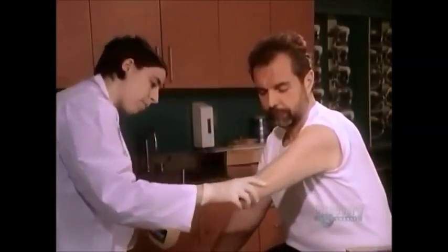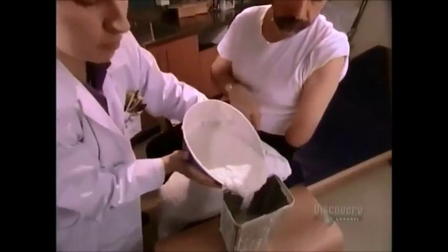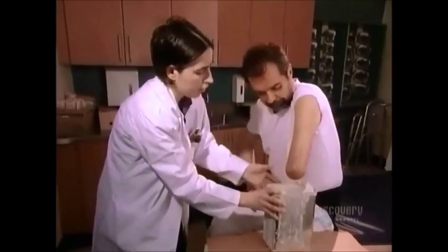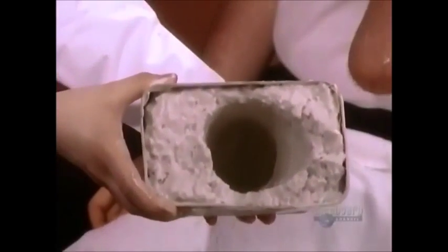They protect and lubricate the residual limb by coating it in petroleum jelly. Then they immerse it in algin, a gelatin-like substance that comes from algae. After about five minutes, they remove the residual limb. The algin has already begun to stiffen and maintain the limb's shape.